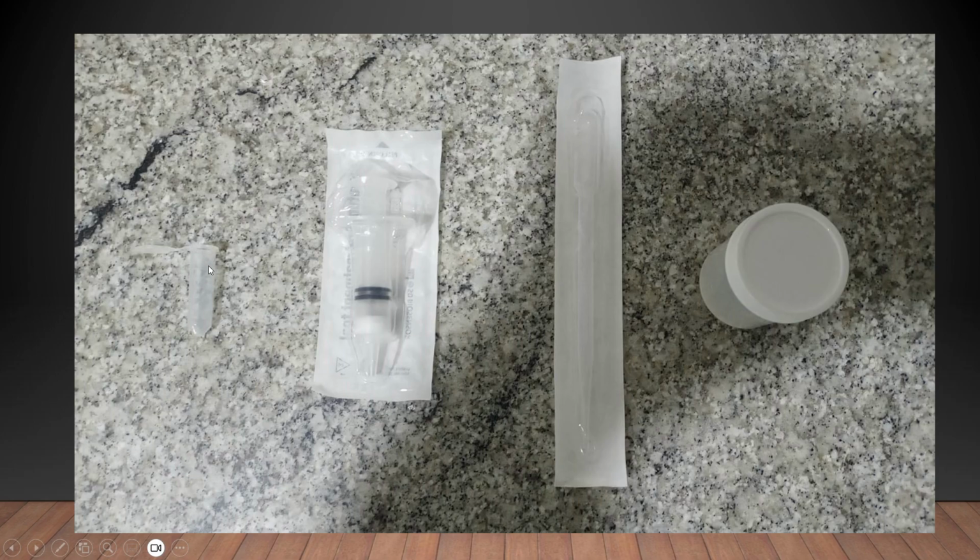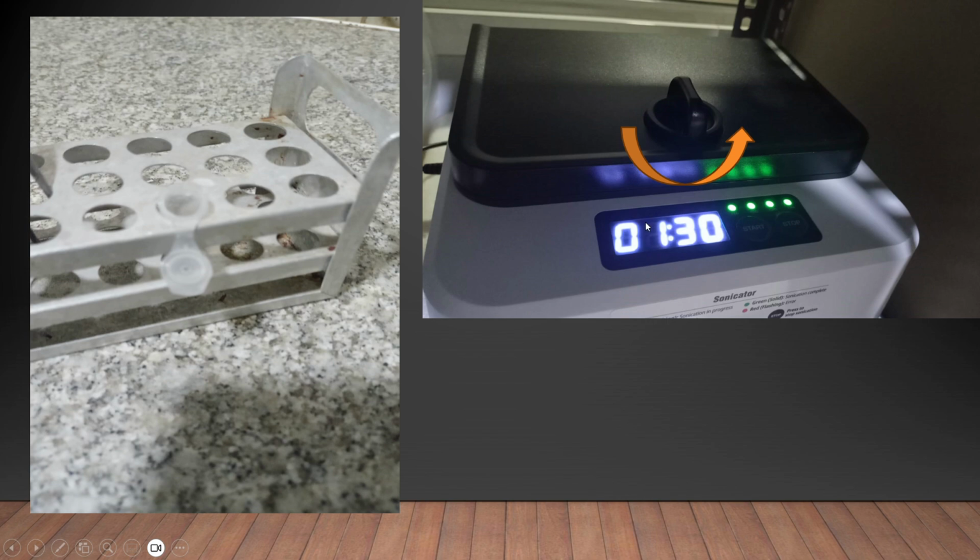This is used for sonication. First and foremost, take this bullet cup and keep it in the rack, and add the incubated solution directly to this. Around 1.5 ml, whatever solution is there, you keep it and then close it properly.